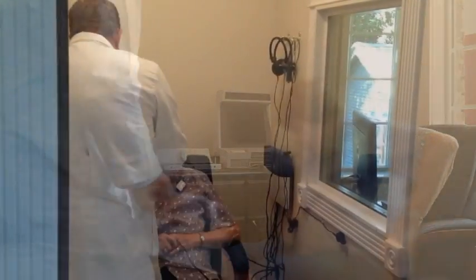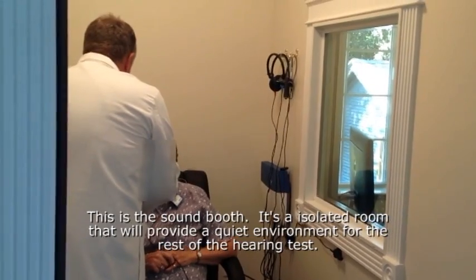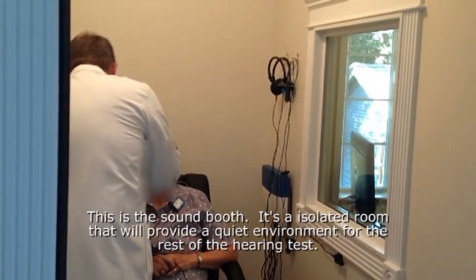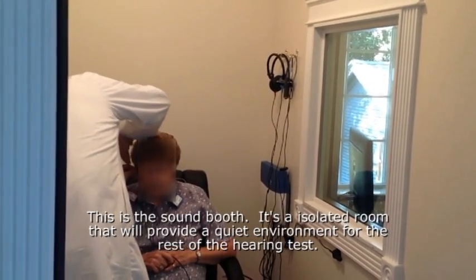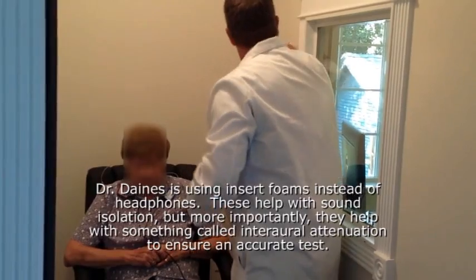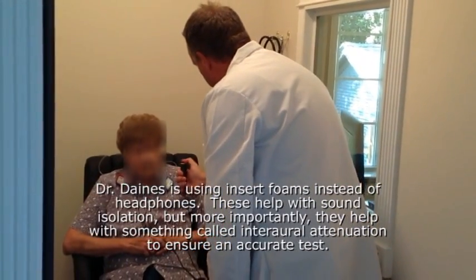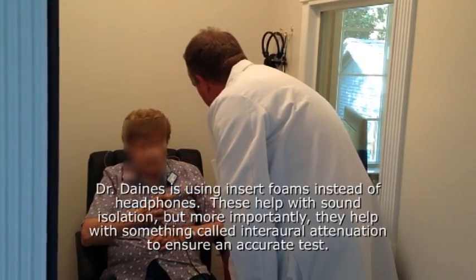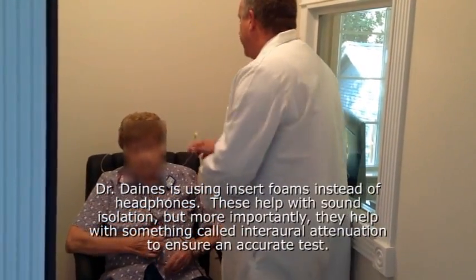Now let's go in this other room and we'll test your hearing. This is that little soft tip. It's just a little foam earplug type thing. It fits down in your ear. Here is the button to push when I play the beeps to you. Just push that button whenever you hear the beep, and then let go. They'll get very, very soft.